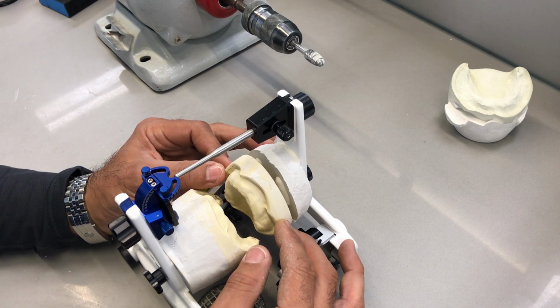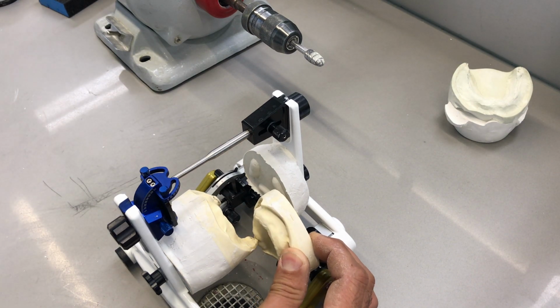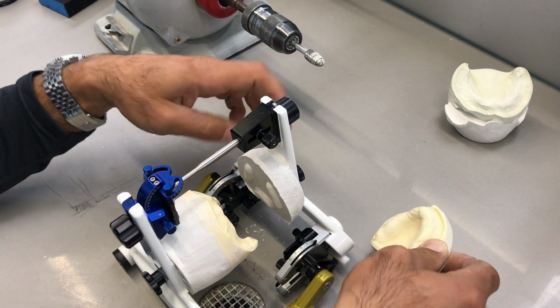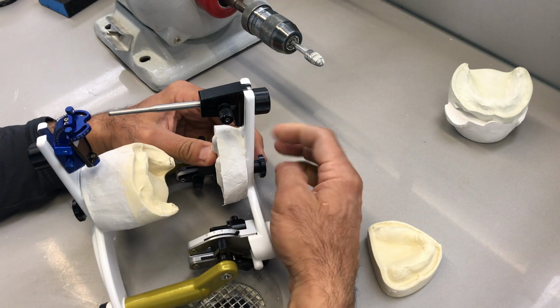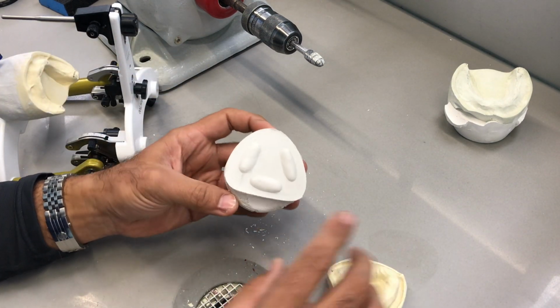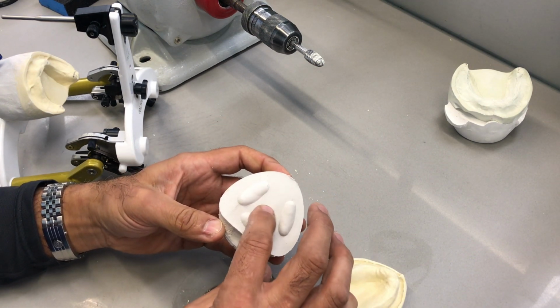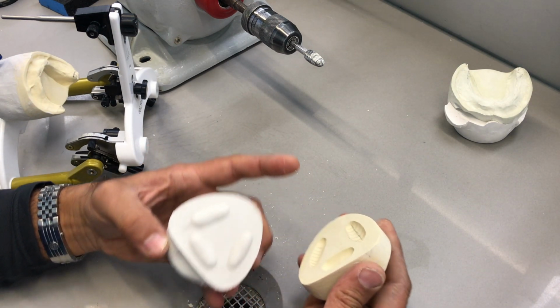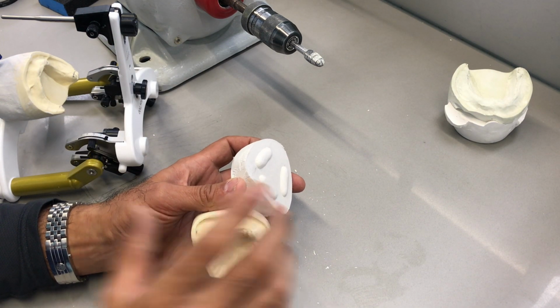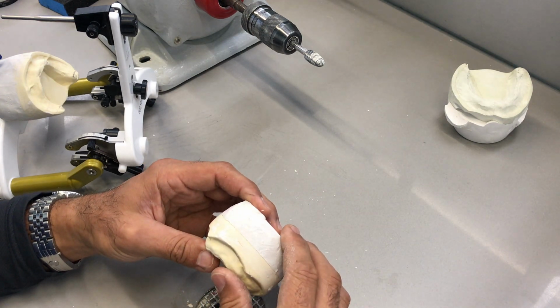And this is one of the reasons why we create keyways. These keyways will enable us to reorient the model back onto the mounting in its correct position. So just to further refine this, I'm going to place this back on here, but notice here we have a little bit of a flash. So just gently scrape that off with your finger to make sure you don't trap any stone in between the bottom of the model and the mounting. So I'll place it back together. So now a nice visual that everything is coming back together.